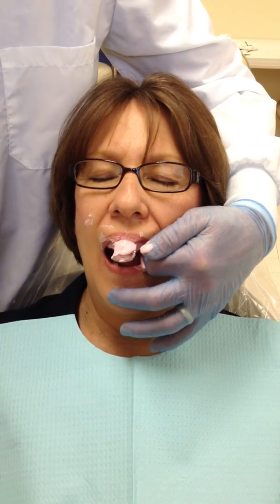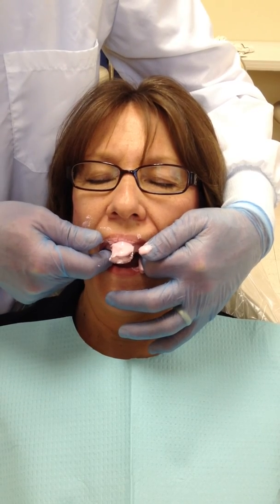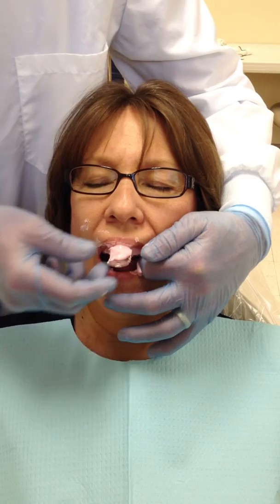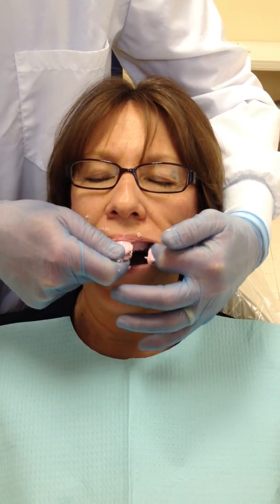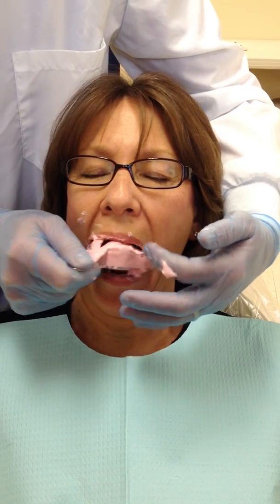Almost. When we remove the tray, we are going to break the seal posteriorly. And that is our impression. Thank you.